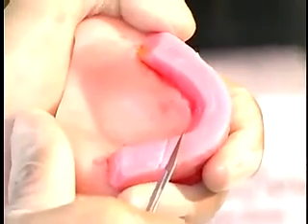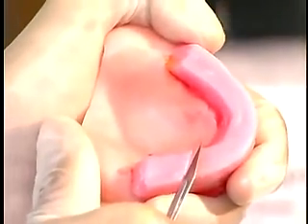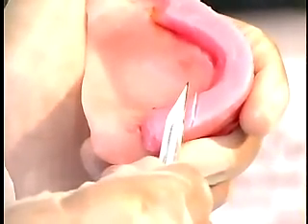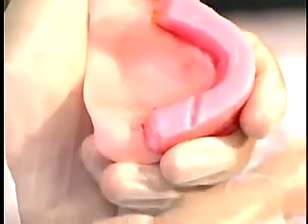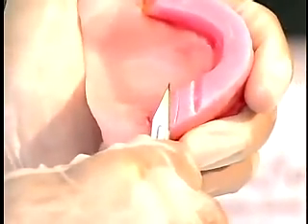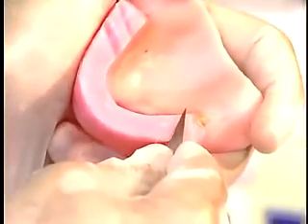Make two V-shaped grooves on the right side of the maxillary occlusal rim, one in the premolar area and one in the molar area. These grooves should not be more than 2 mm in depth. Repeat on the left side of the maxillary occlusion rim.